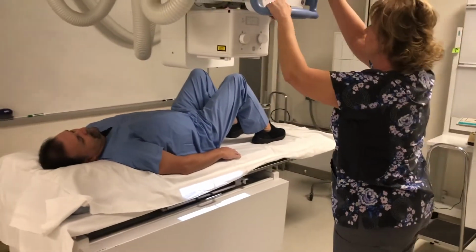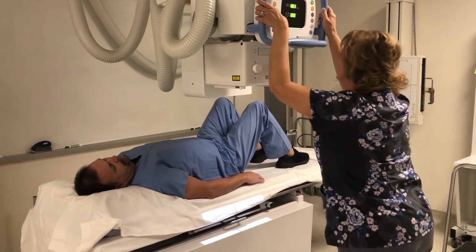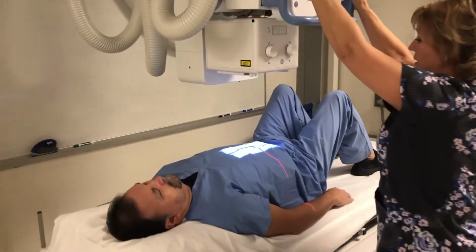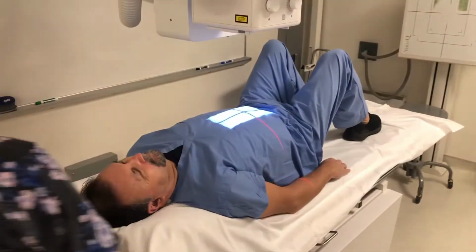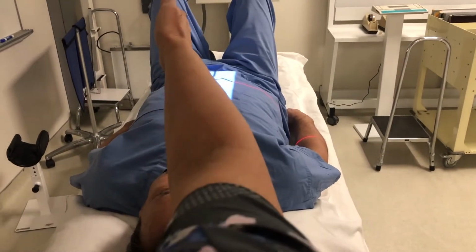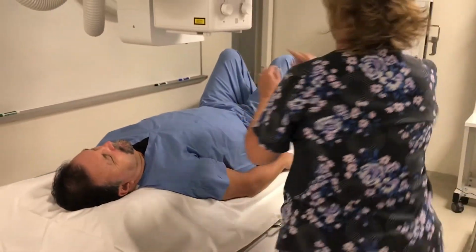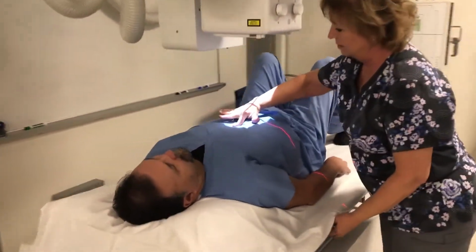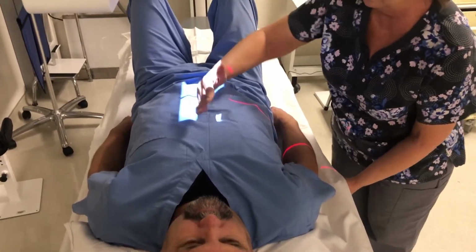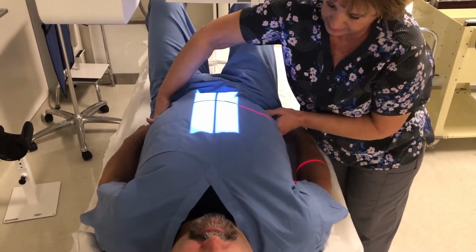Now that I'm centered and aligned, I'm going to detent. Oh, there we go, sorry. Detent it. And then I usually come to the head of the patient and I make sure that their midline appears to be down the midline of the table. He looks pretty straight to me. So I'm going to feel for his xiphoid tip and center on his mid-sagittal plane. And then I'm going to press in on his sides.